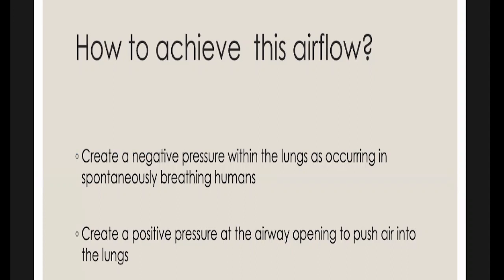By creating a negative pressure within the lungs, as occurs in spontaneously breathing humans, the air goes into the lungs. But during mechanical ventilation, what we do is create a positive pressure, a little different to what really happens in nature. So we create a positive pressure and push air into the lungs through a patent airway, or an open airway. Okay, so that is what we do during mechanical ventilation.